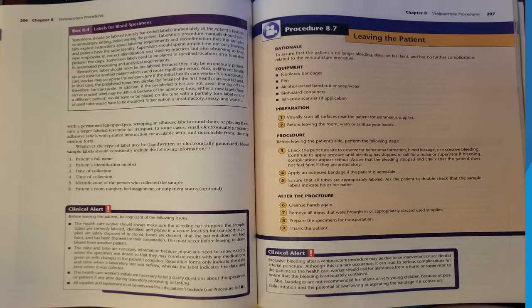Labels for blood specimens. Specimens should be labeled, usually with barcoded labels, immediately at the patient's bedside or ambulatory setting before leaving the patient. Laboratory procedure manuals should contain explicit instructions about labeling requirements and reconfirmation that the samples and patient have the same identity.